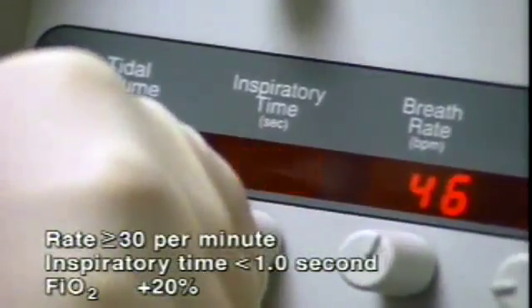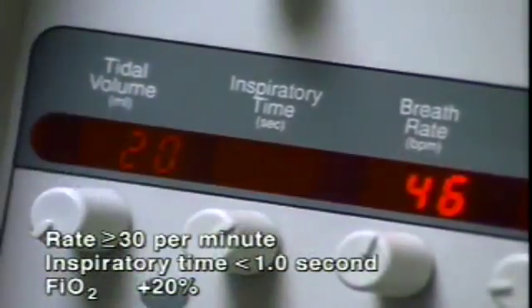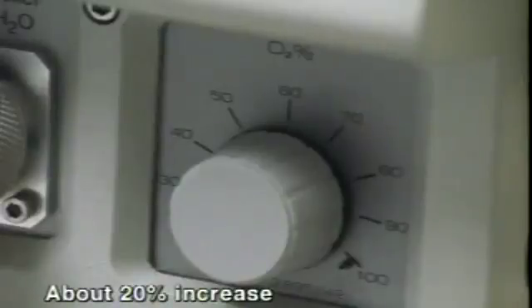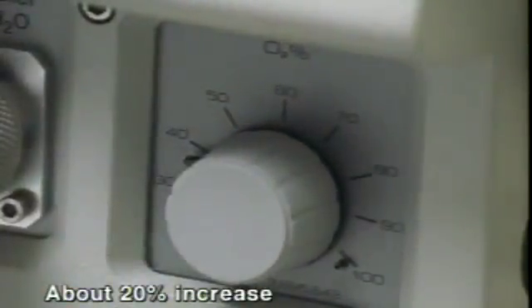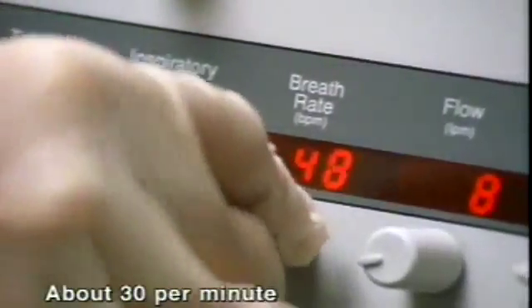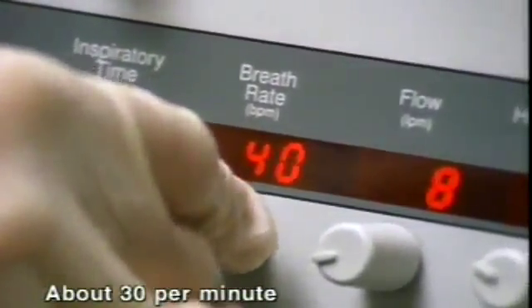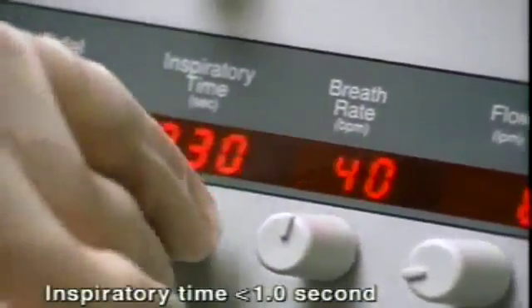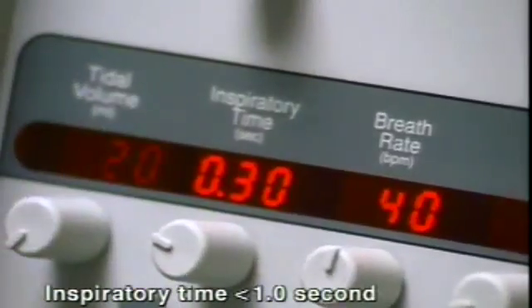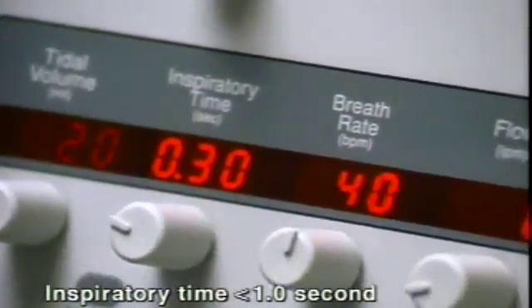Adjust the ventilator settings each time. In clinical studies, ventilator settings were different for repeat doses than for the initial dose. Increase the concentration of inspired oxygen by about 20%, or an amount sufficient to prevent cyanosis. Set a rate of at least 30 per minute with an inspiratory time of less than 1 second. You can always adjust these settings to ensure adequate oxygenation and ventilation.